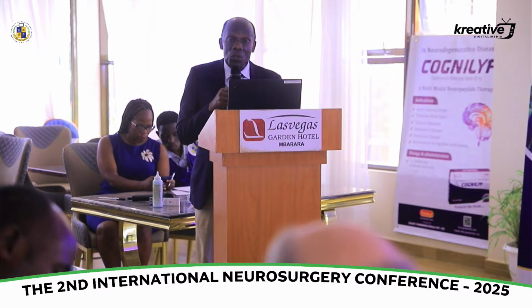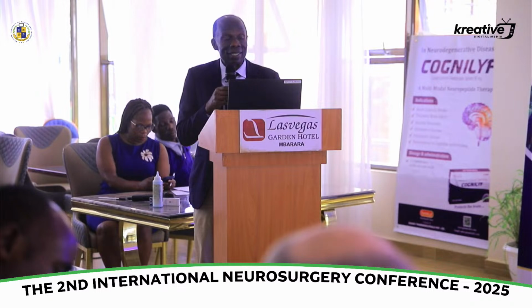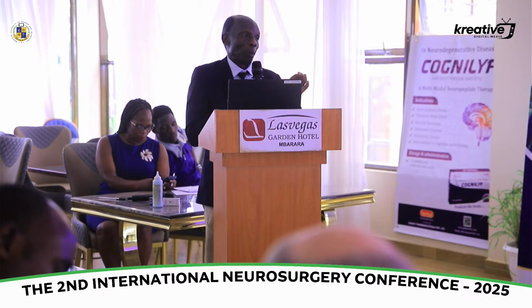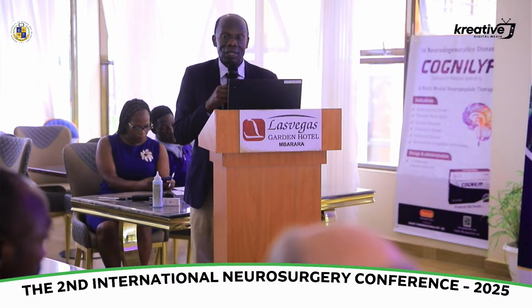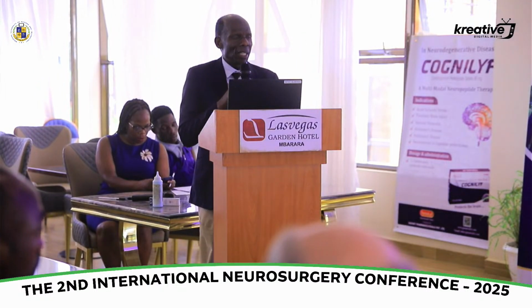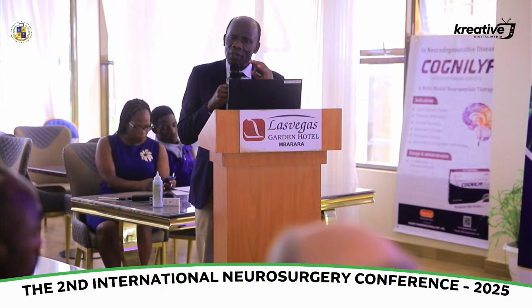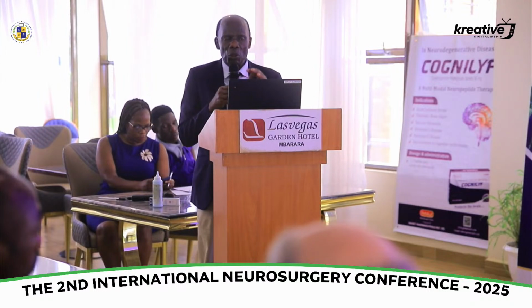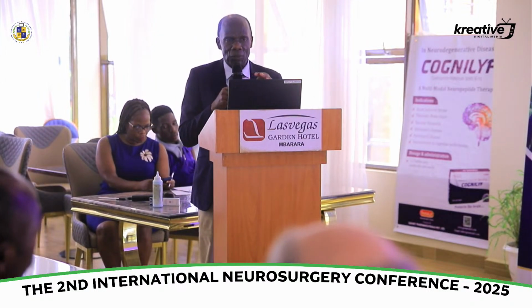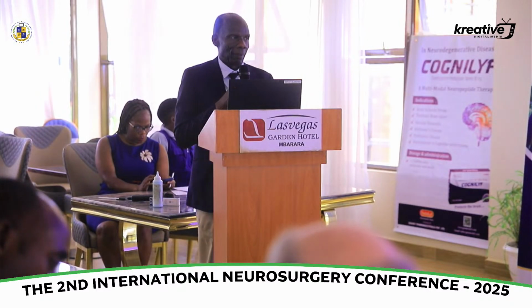He can use ultrasound to diagnose hydrocephalus and aspirate it and temporize this condition. So it is a very important skill which we should master ourselves, especially for us who work in the low and middle income countries.